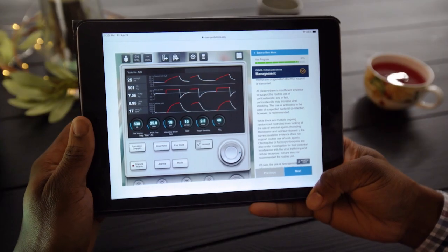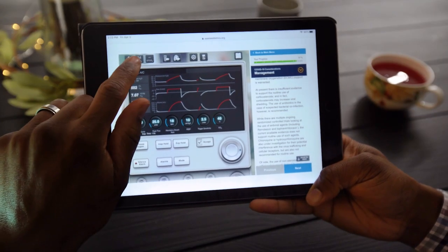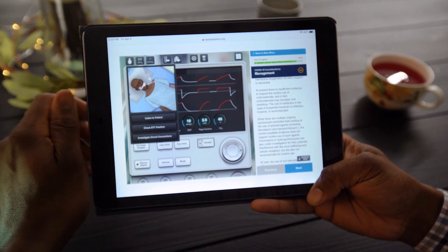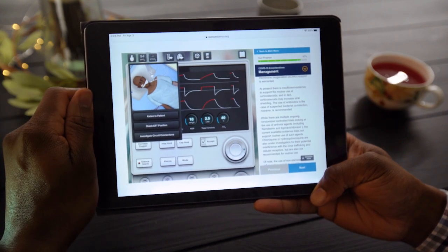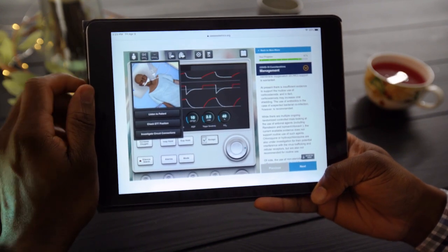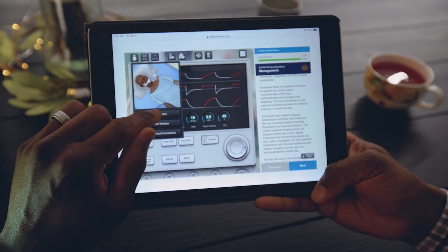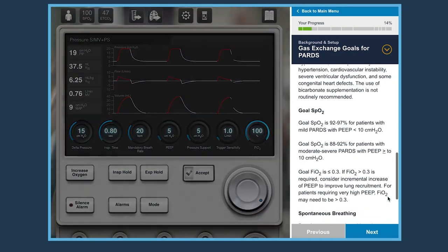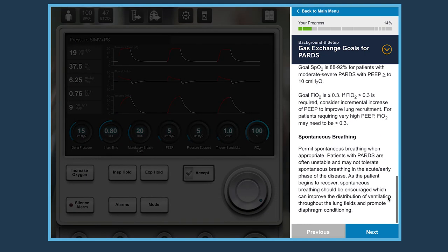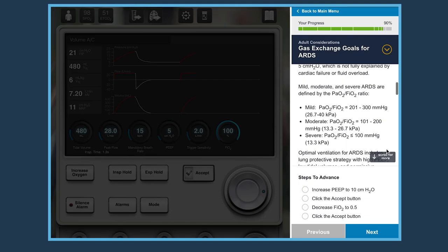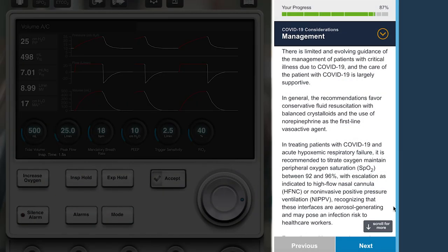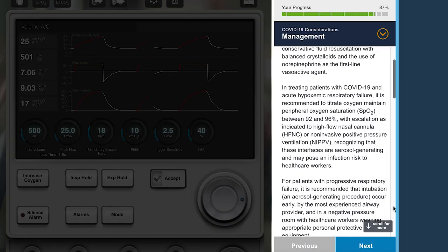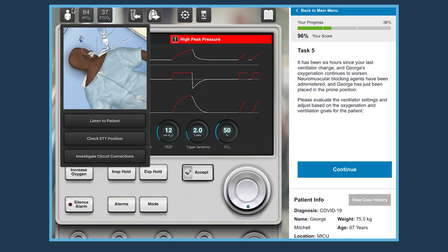The Ventilator Simulator is an immersive online mechanical ventilation training tool. This release incorporates the most recent evidence-based guidelines in pediatric and adult ventilation, as well as COVID-19 information and COVID-19 patient cases.